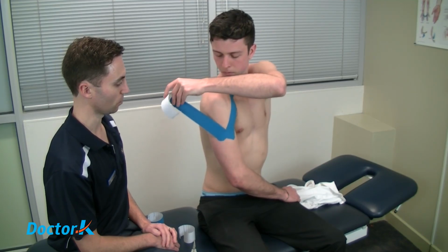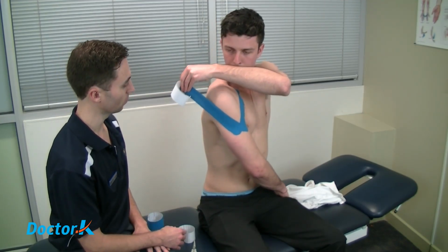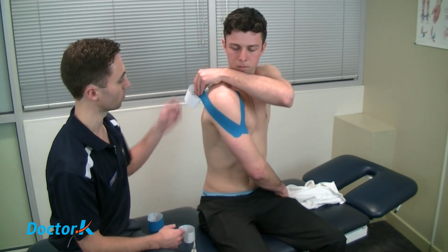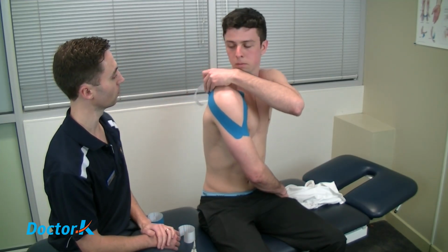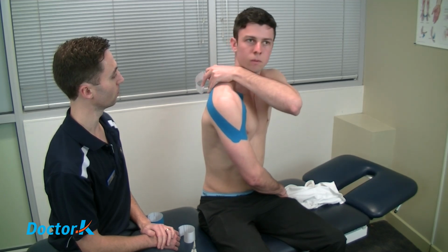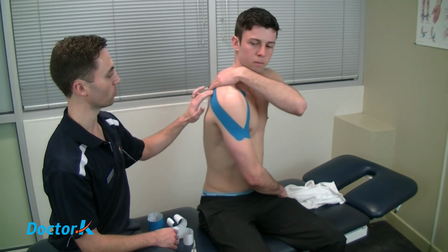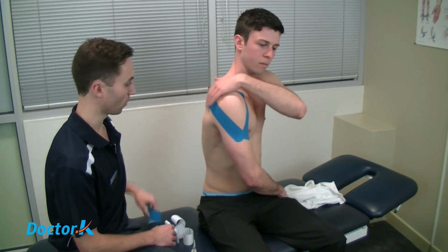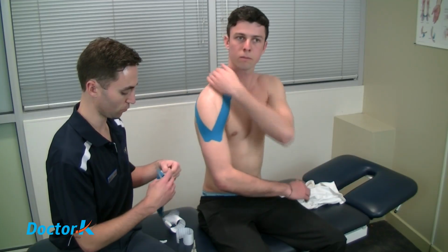And then we're going to follow the contour of that deltoid with your arm reaching across your body a little bit. That's it, and come up a bit towards the shoulder blade as we finish. So we're aiming to try and finish that around about the bony ridge of your shoulder blade at the back. And our final piece, we're going to cross that point of your shoulder.